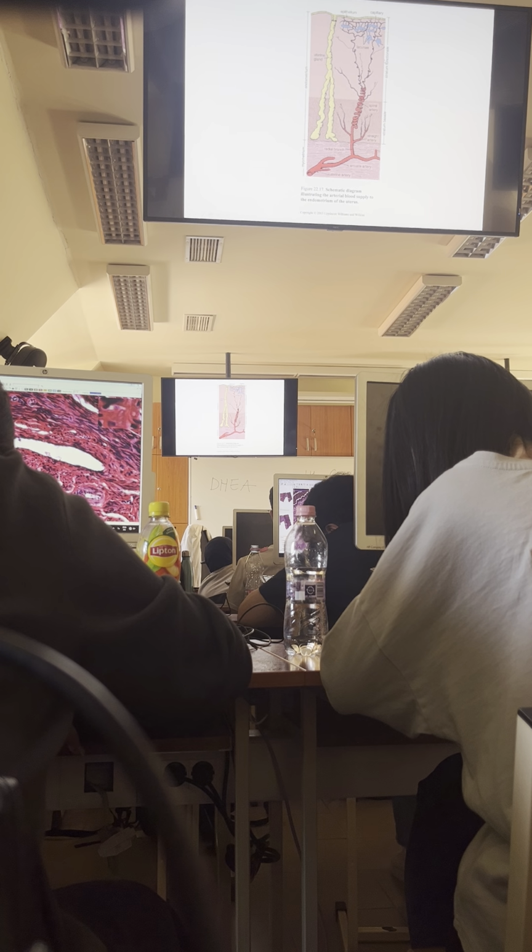Secretory cells of glands. What about them? The location is changing because in the secretory phase they are not centrally located but more basally shifted, because in the apical region the secretum is accumulating. In the proliferative phase the nucleus is in a central position.